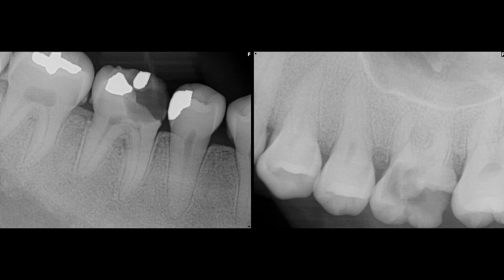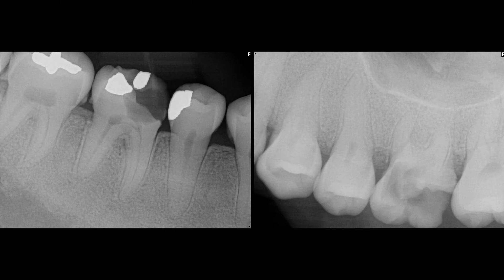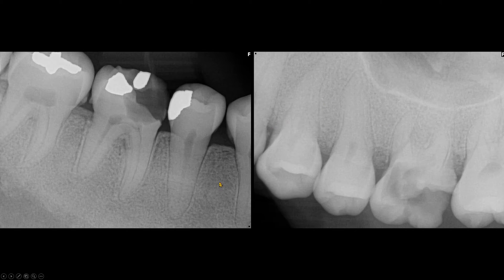The striking findings are in the trabecular patterns. Typically, trabecular patterns are almost horizontal. In these radiographs, you can see that the trabecular patterns are random — here, as well as in the maxillary alveolar bones. These trabecular patterns are small.